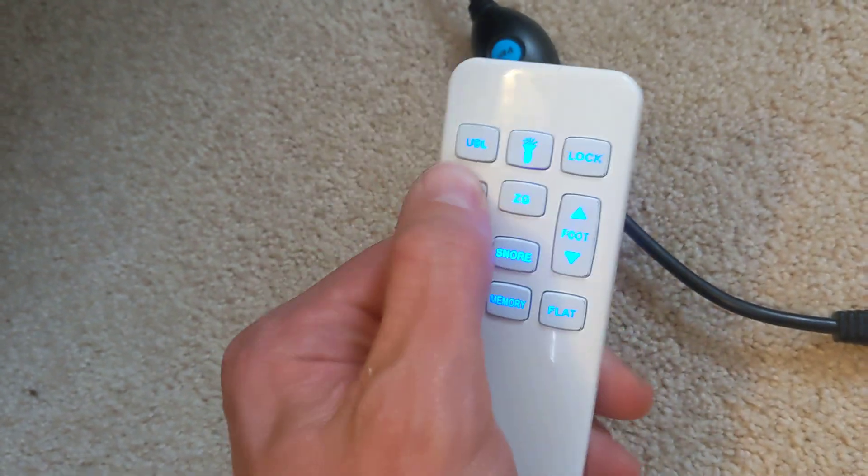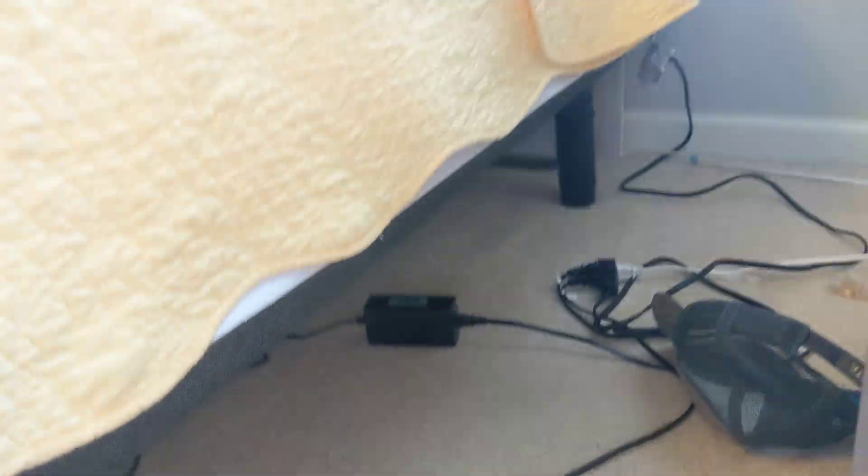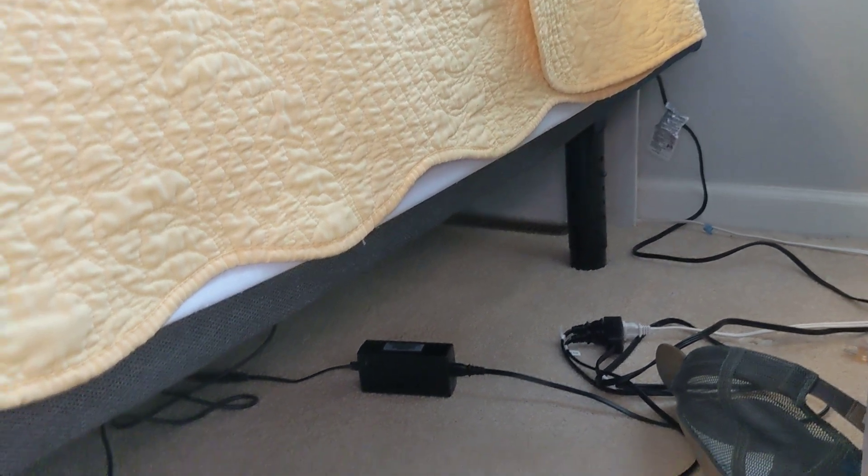That means it's paired correctly. Test it — make sure the bed goes up and down.